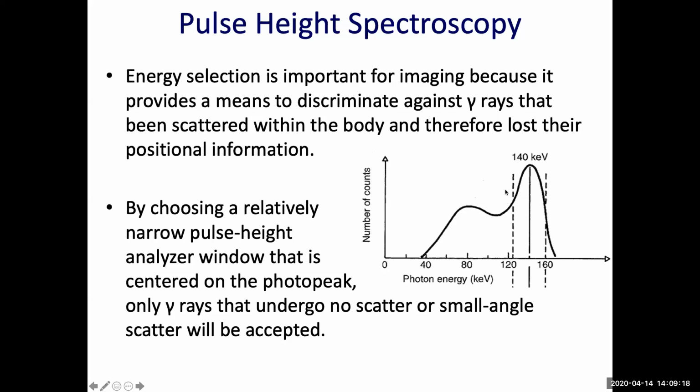Here is the question. Collimator, okay, reduces the scatter photon, but actually the collimator absorbs most of the photons before they interact with the detector. Most of the photons, 99% of the photons emitted by the patient, will be absorbed by the collimator, including scatter and sometimes non-scatter photons. That's why we cannot say its function is to reduce scatter, although it does reduce scatter. It reduces all the photons emitted by the patient that pass through the collimator. So scatter reduction has a role, but it is not the function.